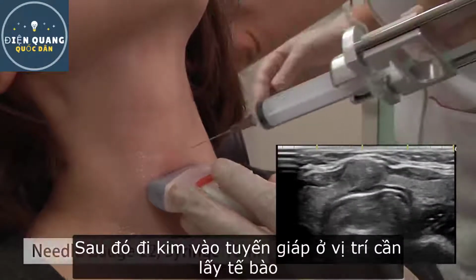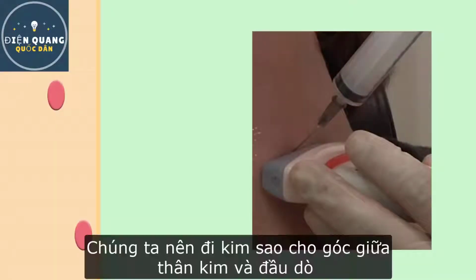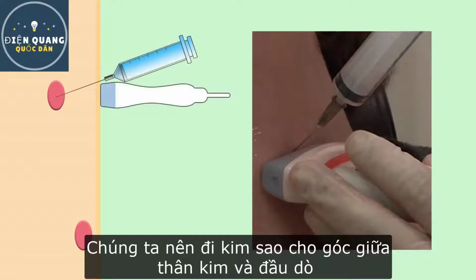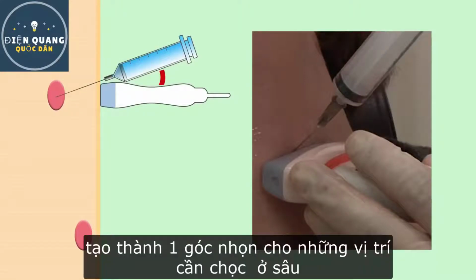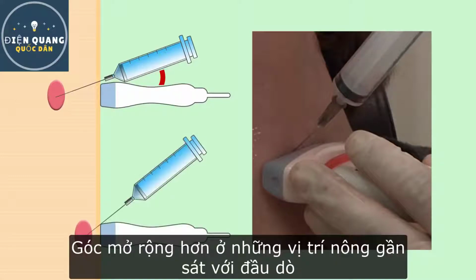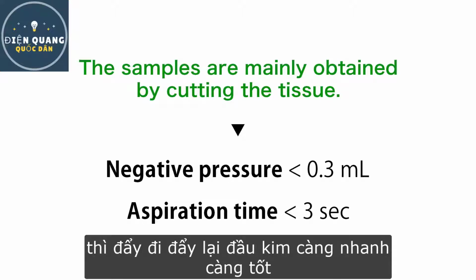Next, we insert the needle. When we insert the needle, for a deeper nodule, we consider a narrow angle between the needle and probe, whereas for a superficial nodule, we consider a wide angle. The samples are mainly obtained by cutting the tissue. Therefore, it is effective to make a piston movement as soon as possible.